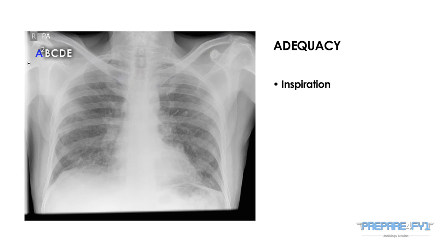I stands for inspiration. You should be able to see at least five anterior ribs in the lung fields. Note we have also illustrated the posterior aspect of the ribs on these films.